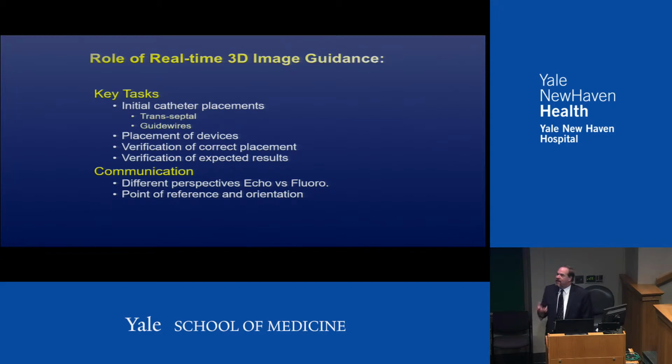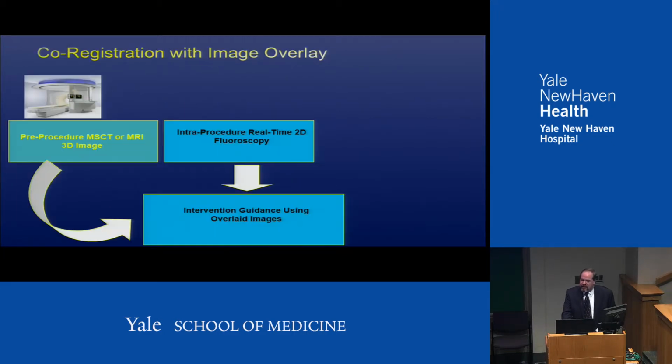What guidelines do we have as far as structure? So is it an aortic valve? Is it a mitral valve? Is it the left atrial appendage? What are those? And I think all those are critical. And then the standard views for going through this. So we're now going to talk a little bit about what are the methods in which we can go through and potentially put this data together.